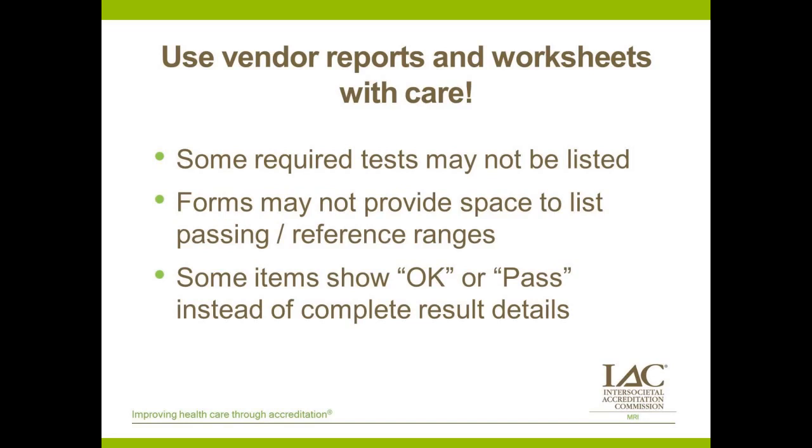However, if you have done each of those items over the course of the year and you have documentation of all of them, then you do meet those requirements. So that's another reason why you want to have a complete history of all of your PMs, not just the most recent, so that you can look back and say, yes, over the course of a year, within that annual time window that IAC requires, we have actually had all these items done. They just weren't all done at the same time. And that's okay. In fact, that's what we expect to see based on the way that most manufacturers set up their preventative maintenance cycles for modern MRI systems.